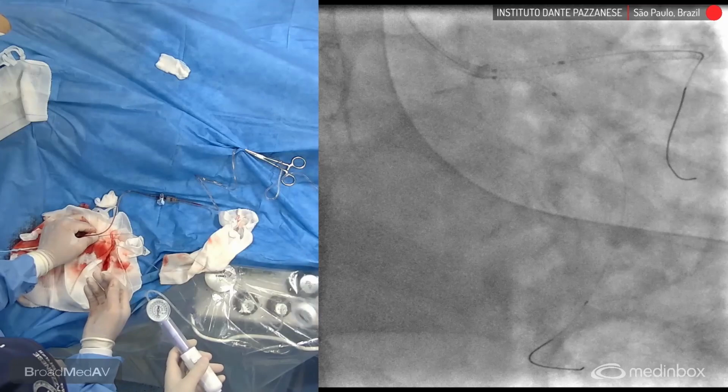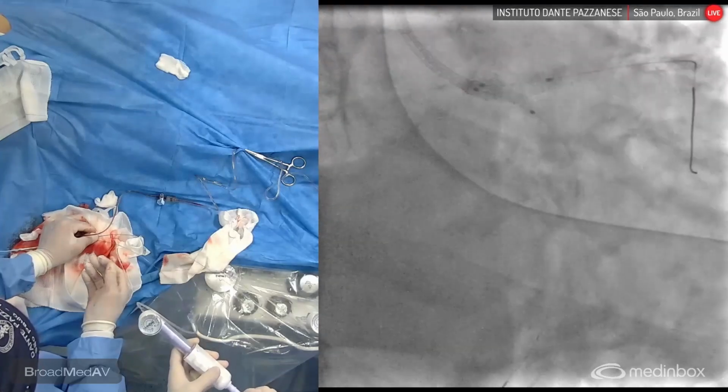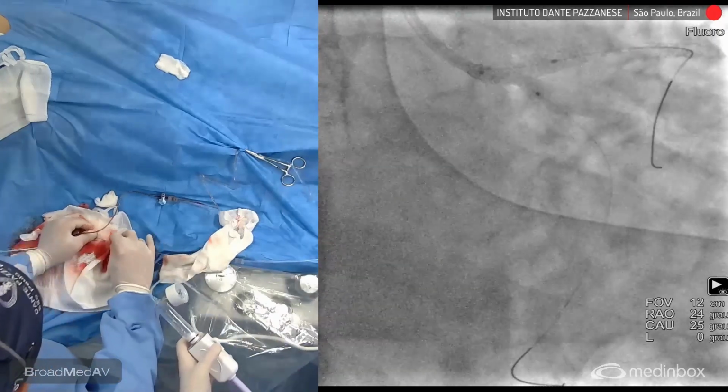Down, one by one here. We're gonna go together, simultaneous here. Okay, 1, 2, deflate. 3. So we went 25.